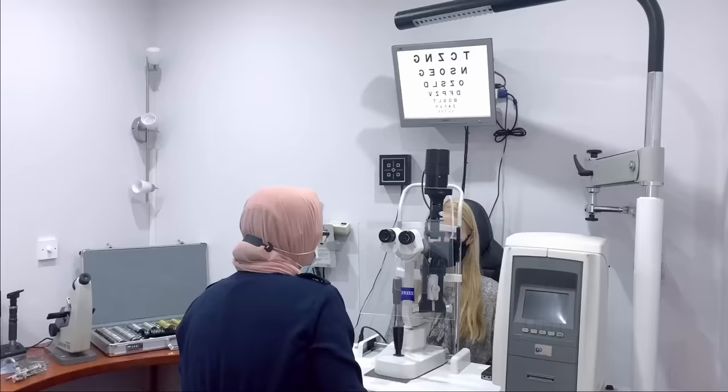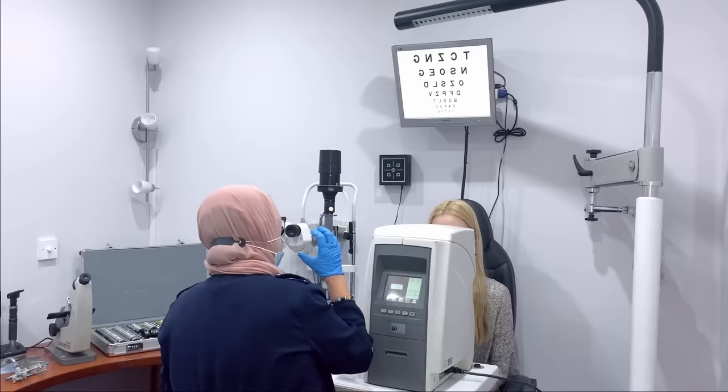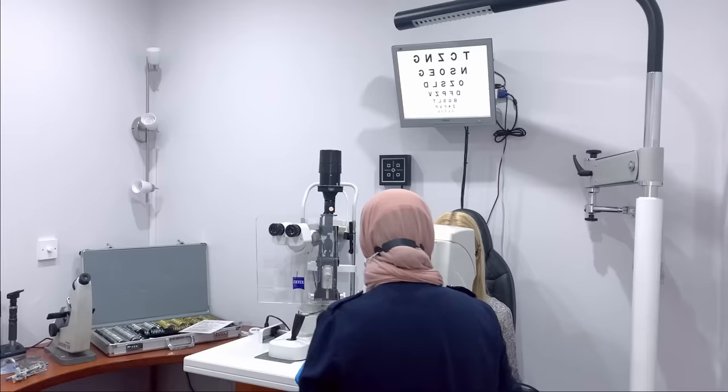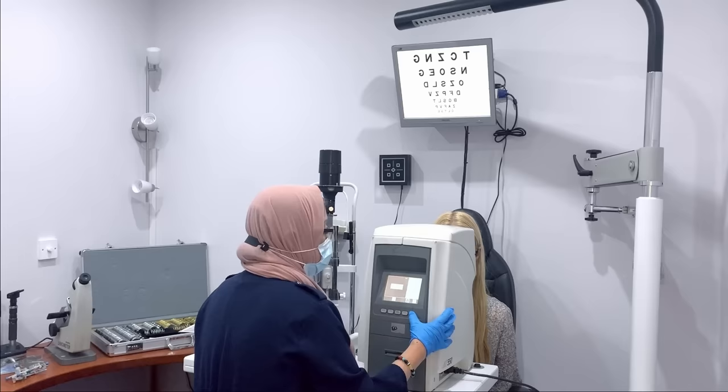Okay. So it's like a pressure measurement of the eyeball itself, the tension of the eyeball, okay? Just to make sure that all is well, okay? We do this for everyone. Can you see a green dot? Okay. So just stare at the green dot, okay? And I'm going to take three measurements, okay? Are you ready? Yeah. We're about to start. Here we go. Keep very still. Good. Another more. Ready?